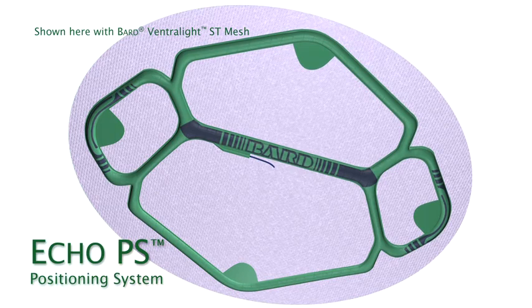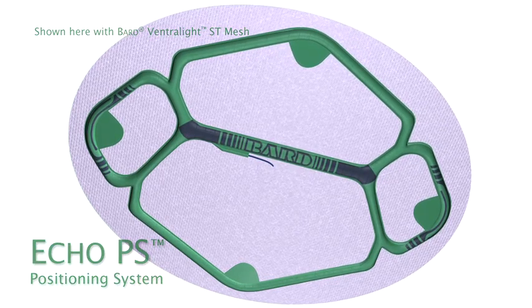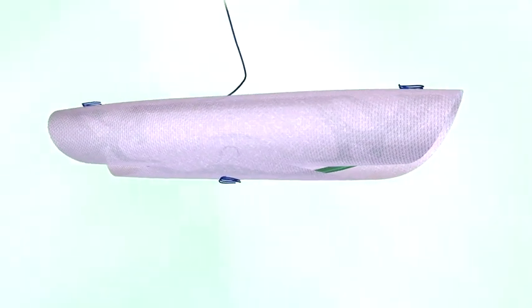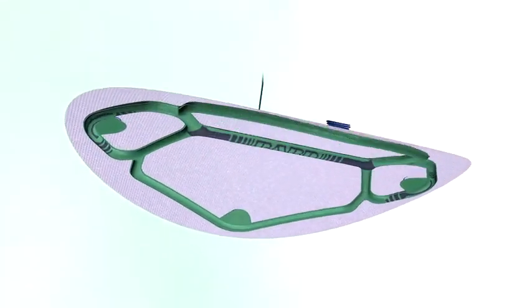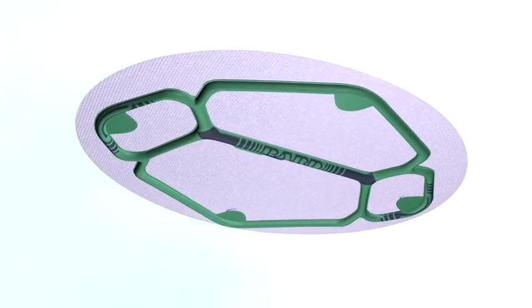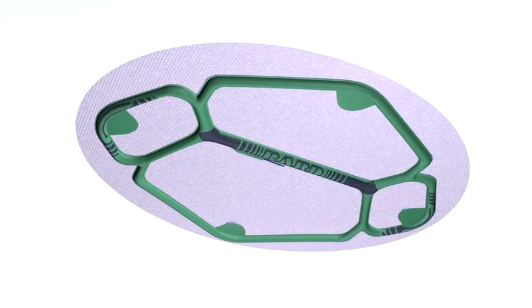The ECHO-PS Positioning System is designed for today's laparoscopic surgeon to facilitate an efficient and reproducible repair. It consists of a low-profile balloon that comes pre-attached to a piece of Ventralite ST Mesh.